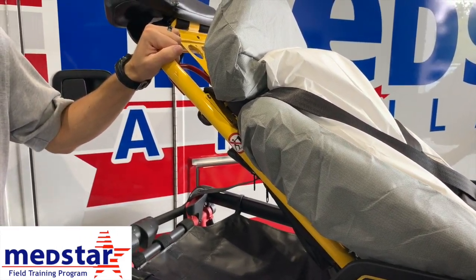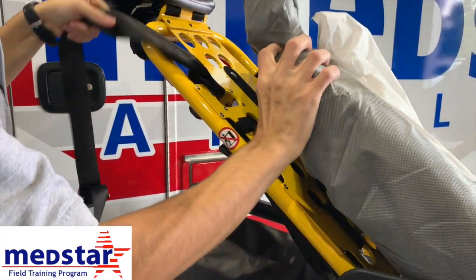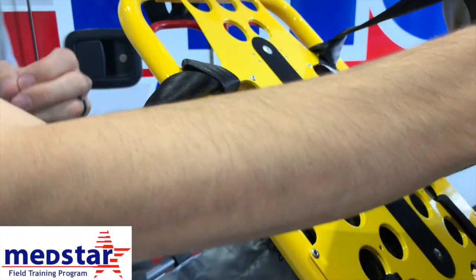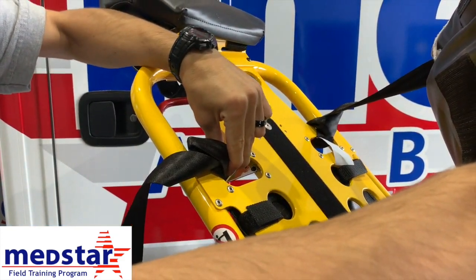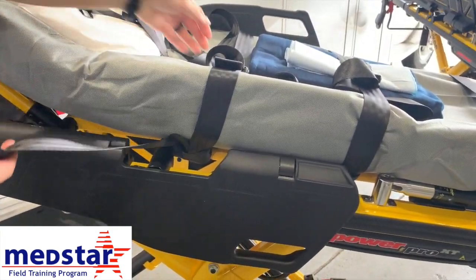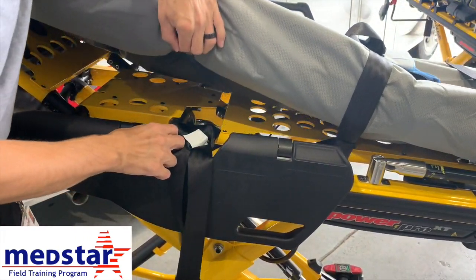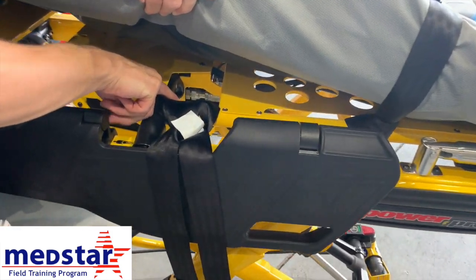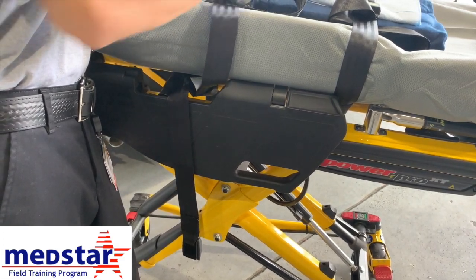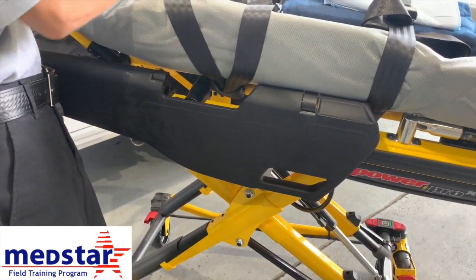With the Stryker Power Pro XT, the X-Restraint system loops in a slightly different way. Up on the top, it loops through a specific hole, unlike previous stretchers where it looped differently — it has a specific destination. The X-Restraint strap has two ends: a male and a female end. It loops through the bracket, and the male end goes to the female buckle for the hip harness, while the female end goes to the male end on the X-Restraint.